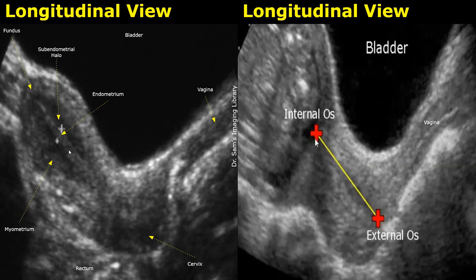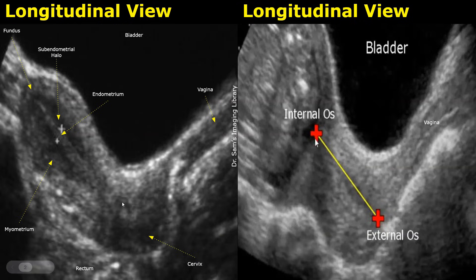The outermost layer of the uterus is the serosa. It appears as a thin hyperechoic border. On the right is a close-up image focusing on the cervix, shown in a pregnant uterus, to illustrate the internal os and the external os. The internal os is the junction between the cervix and the body of the uterus.